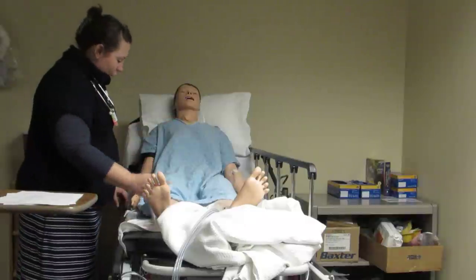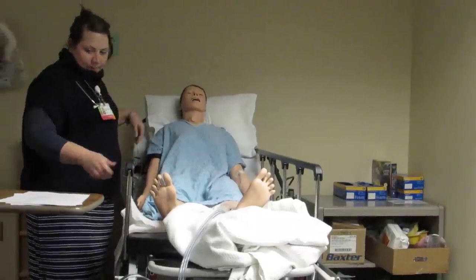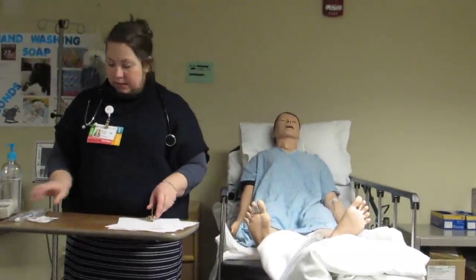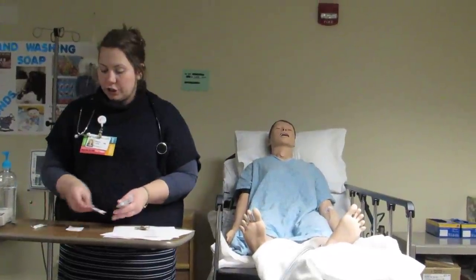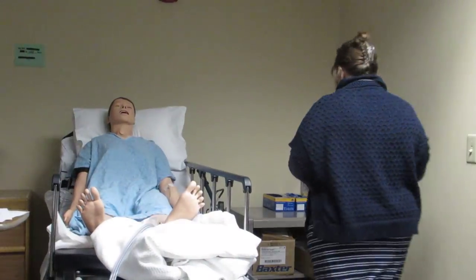At this point, I am going to go over and I'm going to flush my IV. So I'm going to take my supplies, my flush, my alcohol swabs. I'm going to put some gloves on.